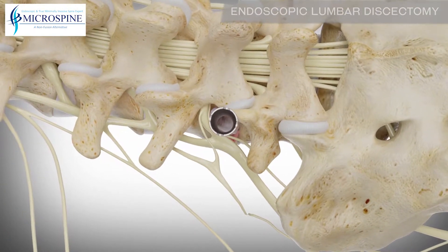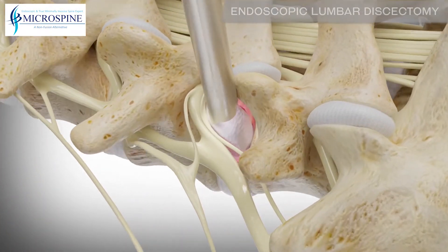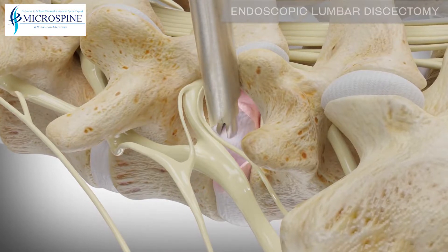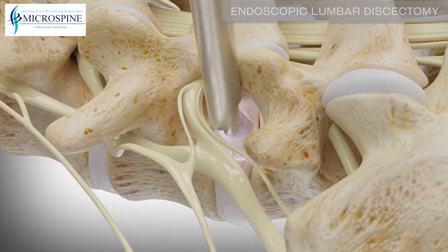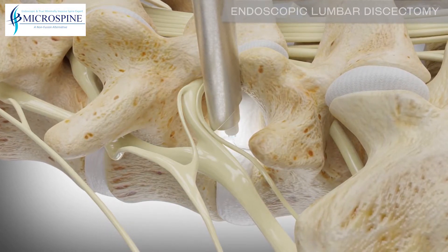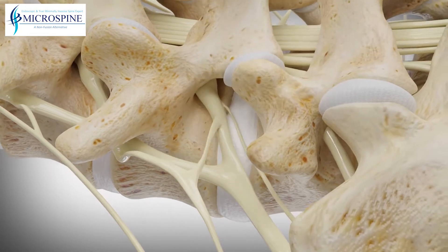A spinal endoscope and specially designed surgical instrumentation are used to remove the disc herniation, thereby relieving the pressure on the nerve. A radiofrequency probe is then used to close the annular defect. This procedure can be done through a single incision and closed with a small bandage.